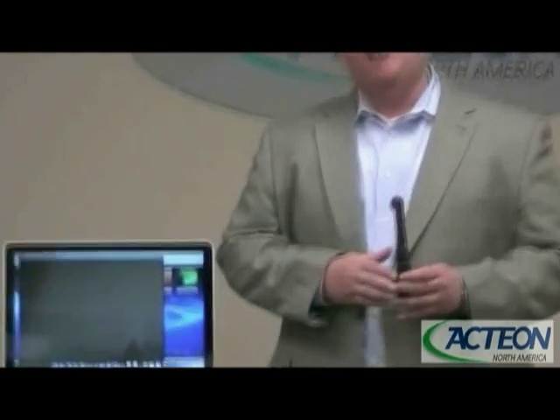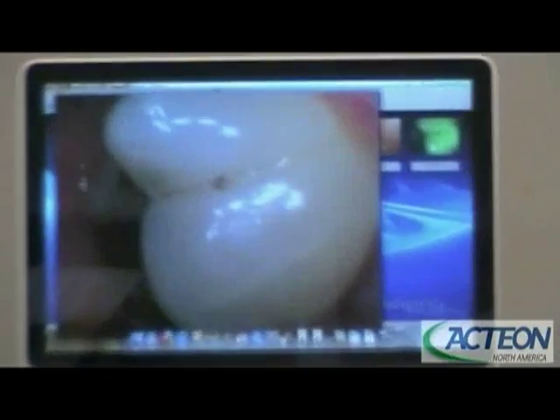We're going to take a look at a couple of shots showing you what they look like in both daylight and diagnostic. In this shot, you're able to see a fracture line running through the center of that tooth with a dark space there. As soon as we hit mode one, which takes us to our diagnostic view, you see the healthy dentin but you also see this red spot in the middle — what that's showing you is that we have affected dentin decay, or caries.